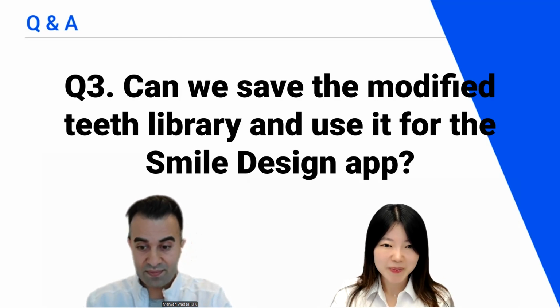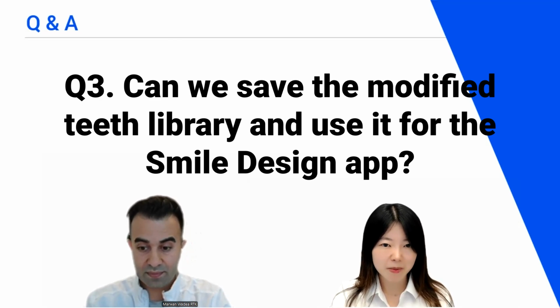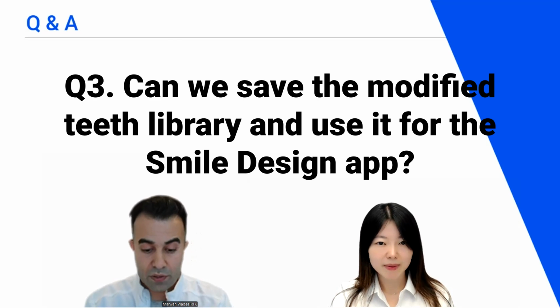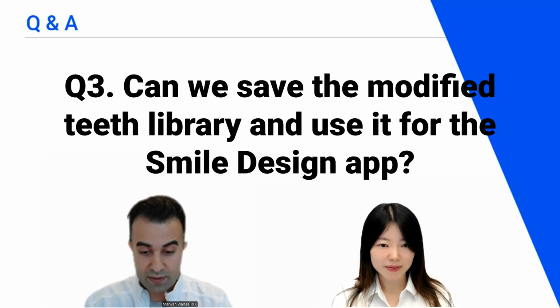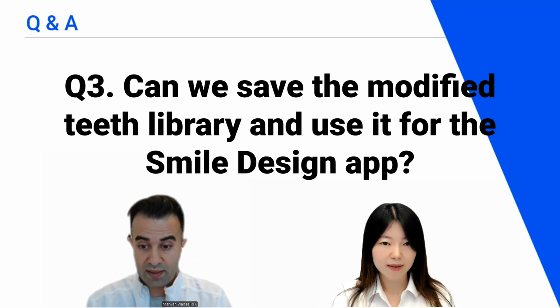Okay, last one, question number 3. Can we save the modified teeth library and use it for the Smile Design app? Yes. Once we obtain the 3D teeth library, you can see it's time consuming. However, we're going to do it only once. Then we can export it to the Medit Link and keep it there.